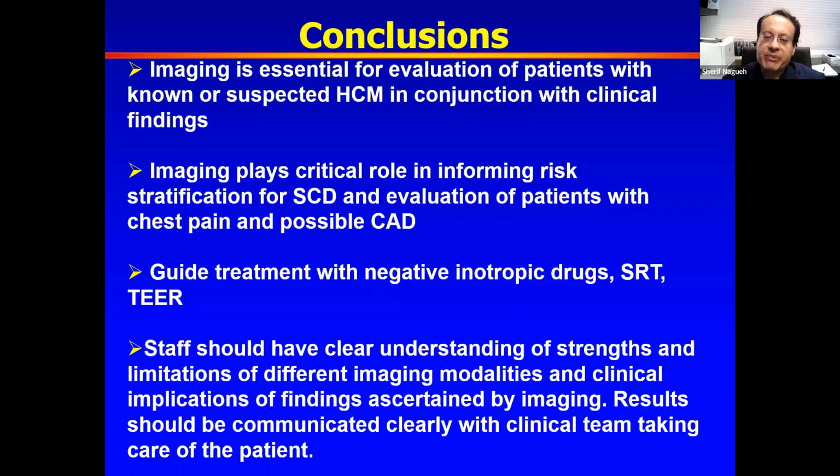Do you find a pre-op TEE needed? Helpful for pre-surgical myectomy planning in a low volume site? How about a recent case with myectomy with residual significant SAM, dynamic obstruction, long anterior mitral valve leaflet.